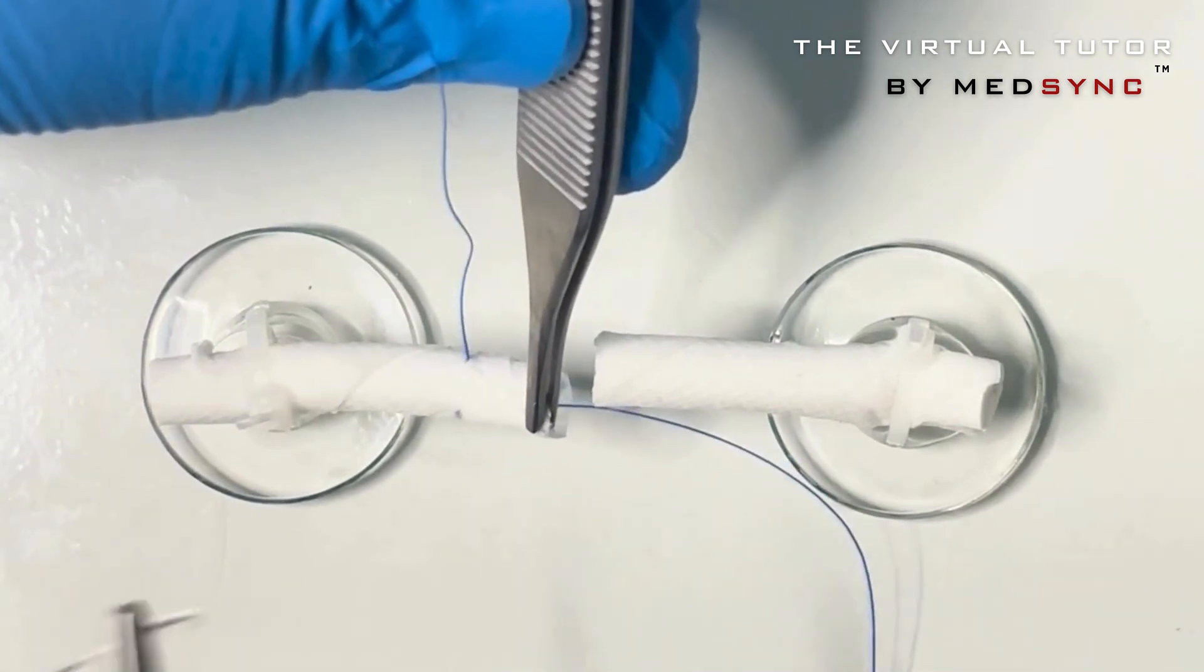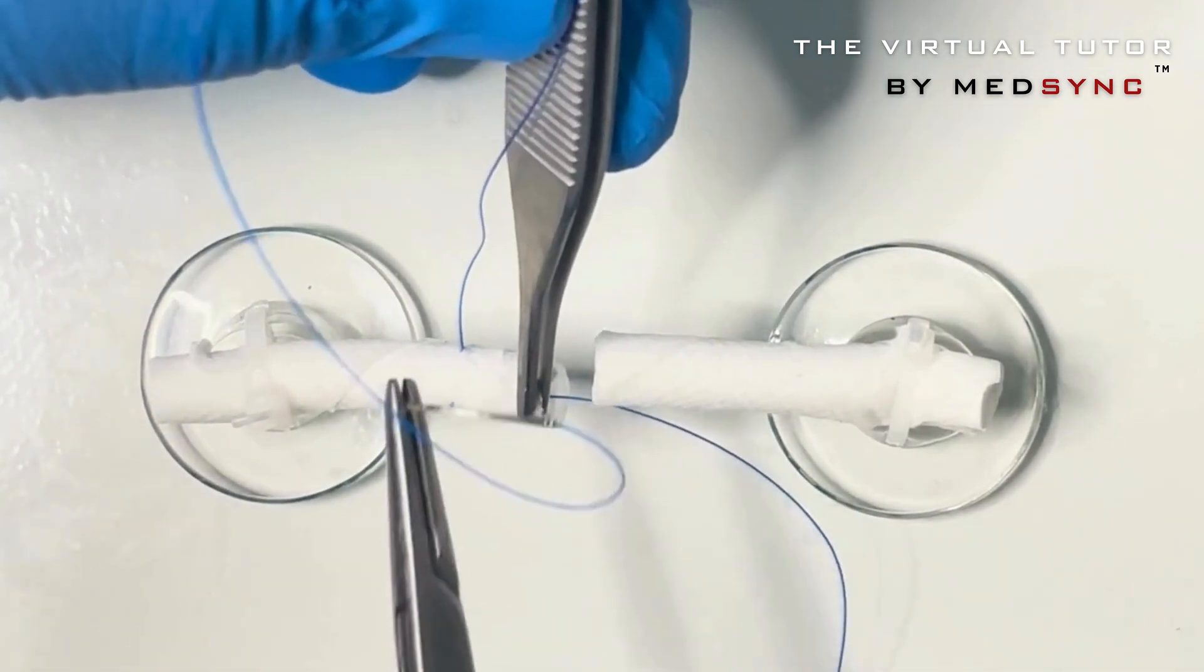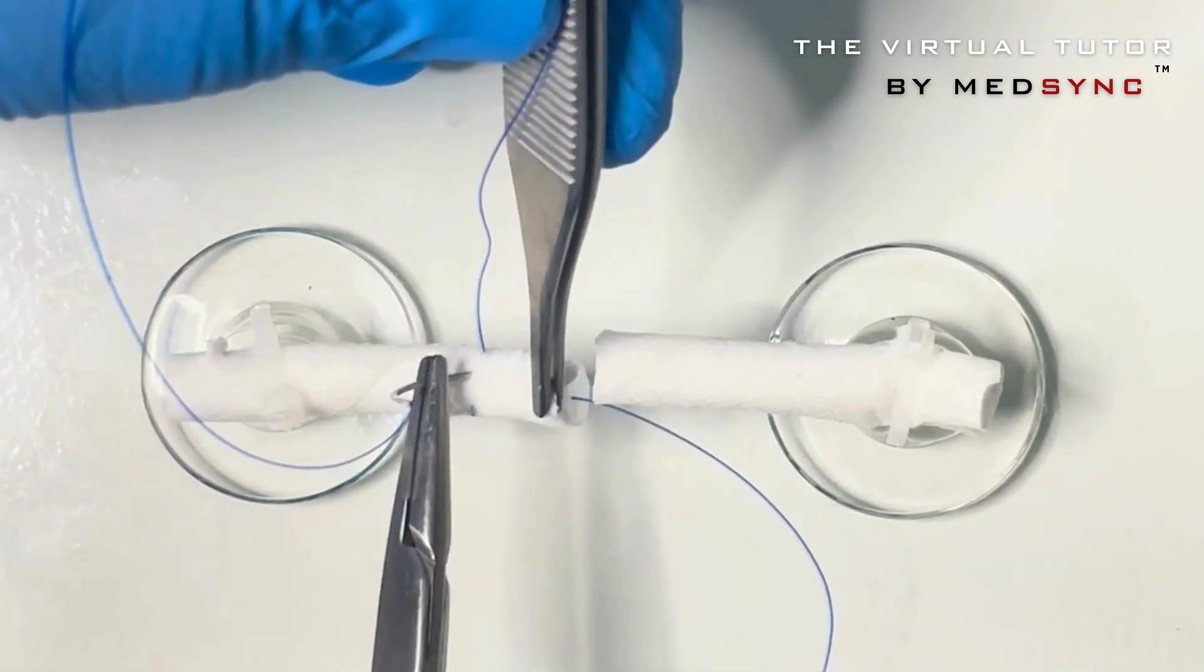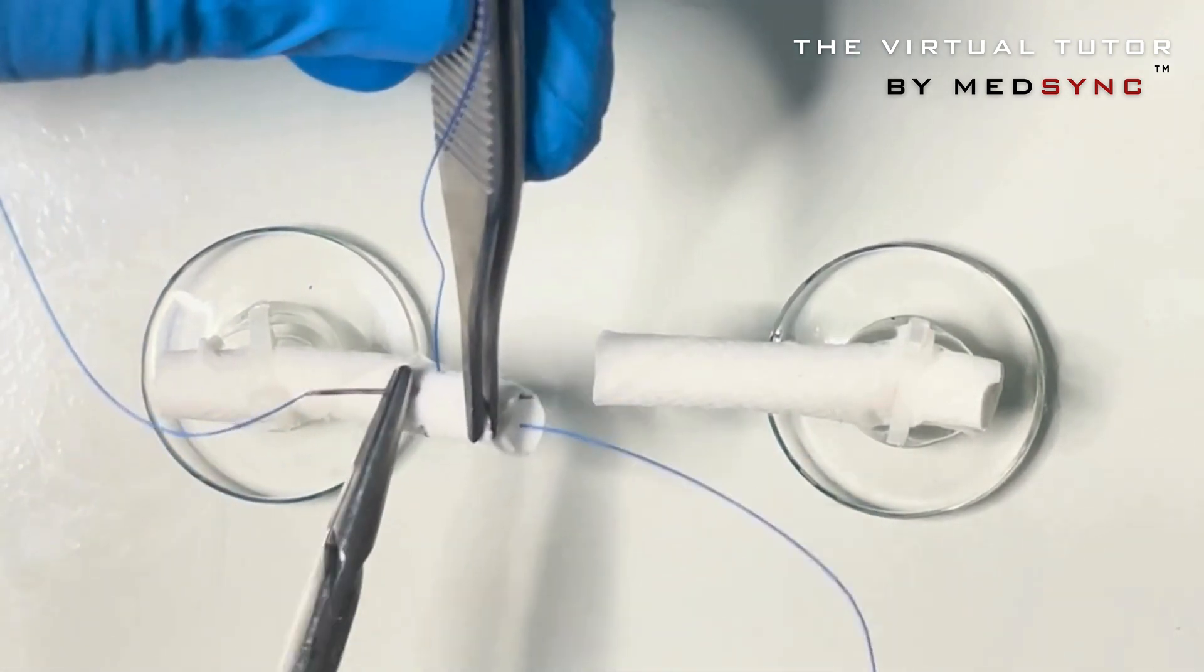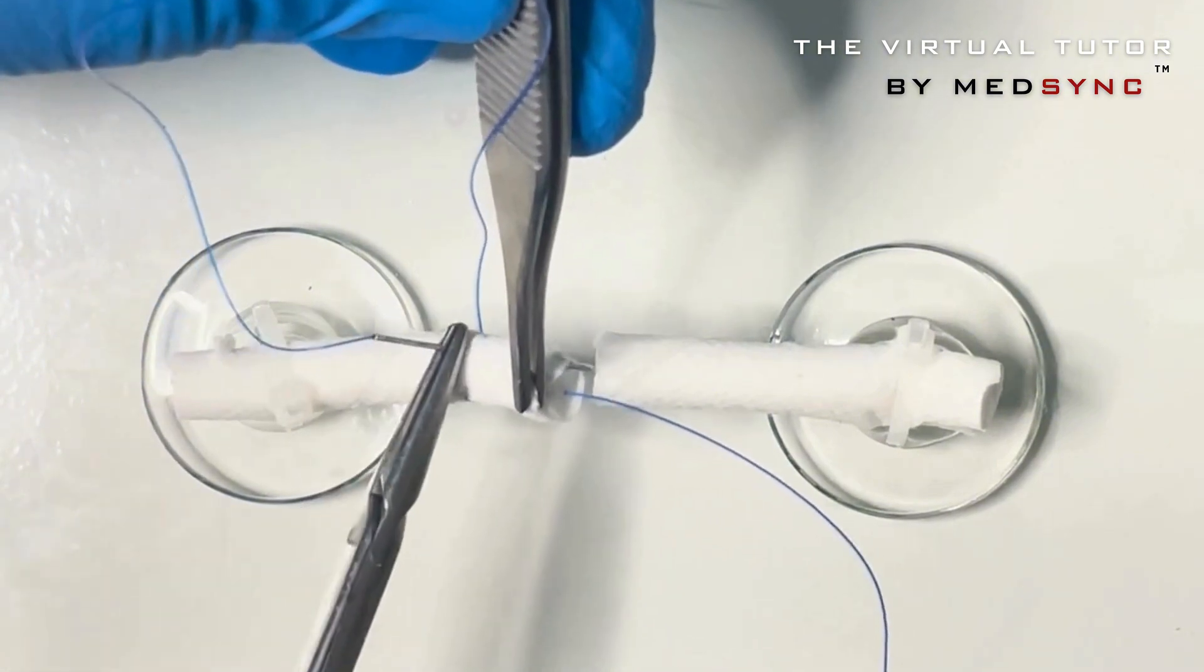You finish with a straight bite, mirroring the first but starting far and ending in the middle at the site of the cut tendon ends.